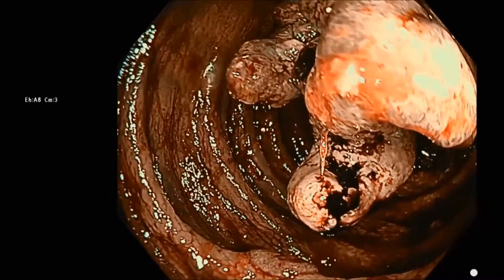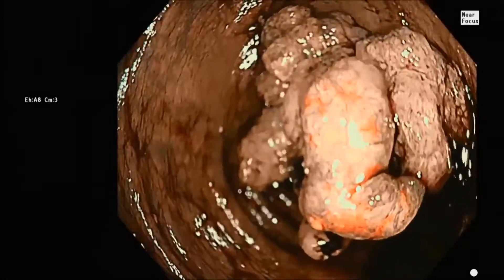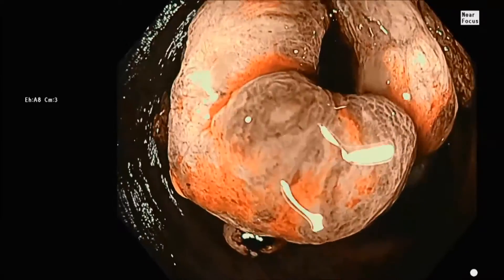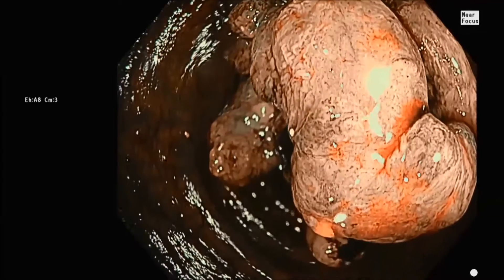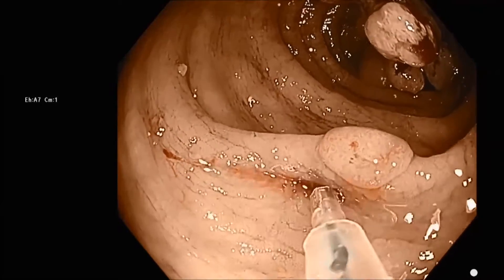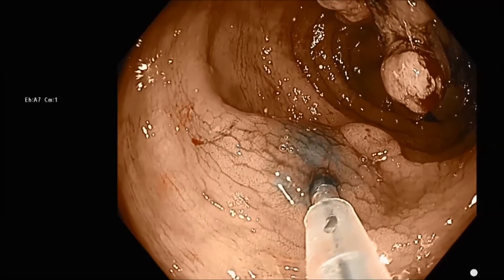At this point in the video, we're looking at a tumor. We can tell this is cancer because it's got this very ratty appearance. If you look at the surface, you can see that the vascular pattern is disrupted — that's the nice type 3 pattern. It tells us there's deep submucosal invasion.